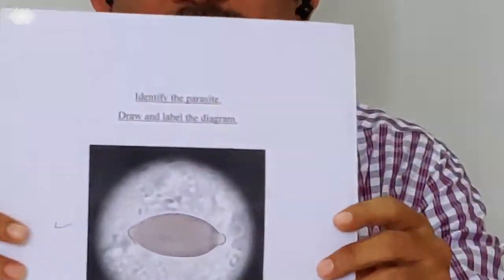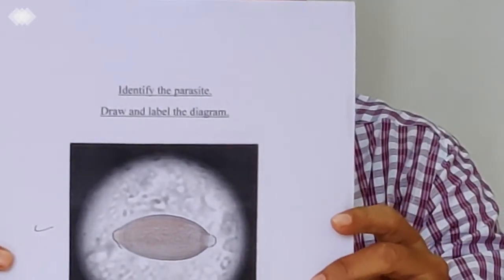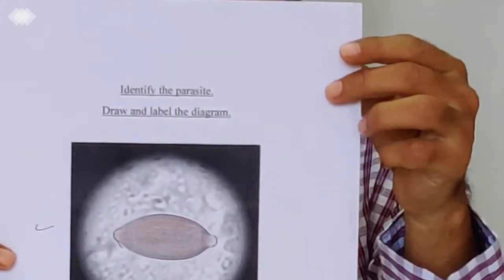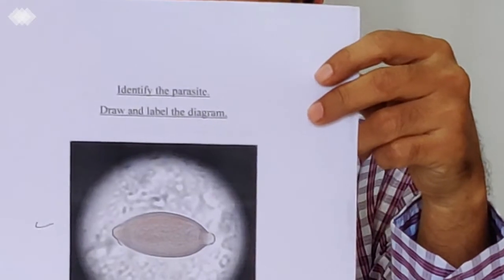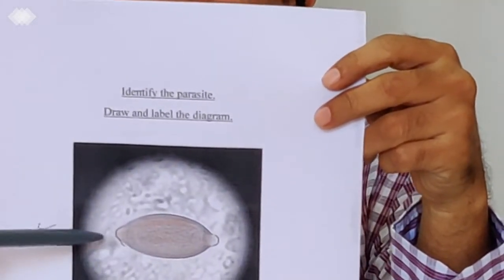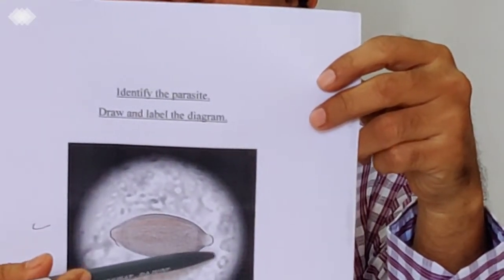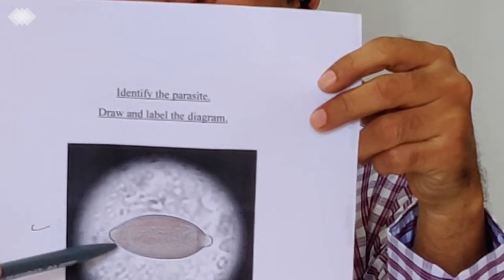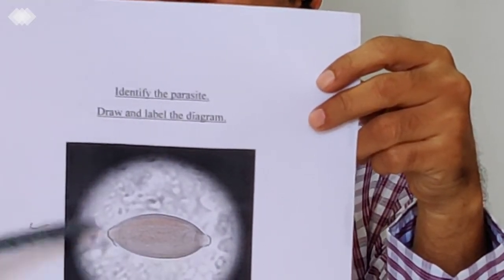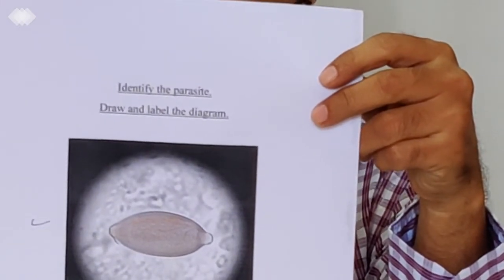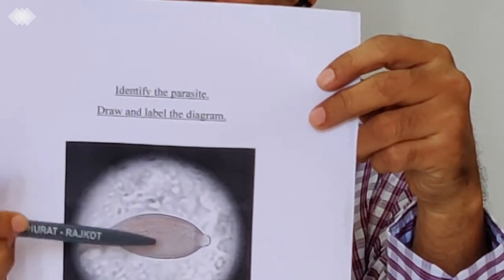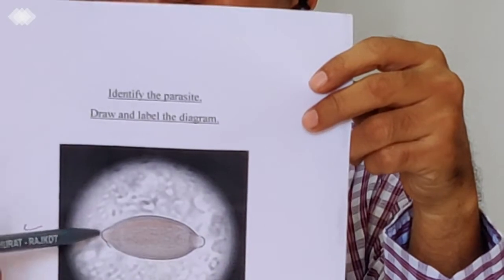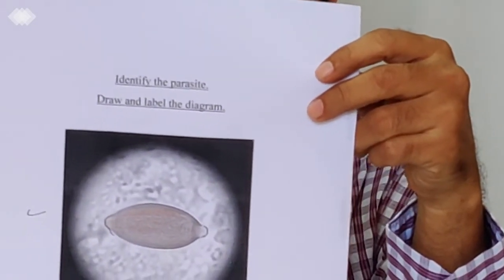The next egg, which is again bile-stained, this is known as egg of Trichuris trichiura. The unique feature of this egg is, you can see that there would be at both the ends, there would be polar mucus plugs. So, that is a characteristic barrel-shaped egg with these two mucus plugs, that is Trichuris trichiura.